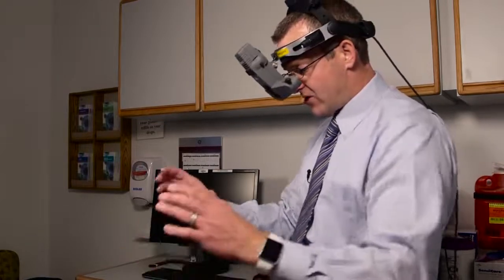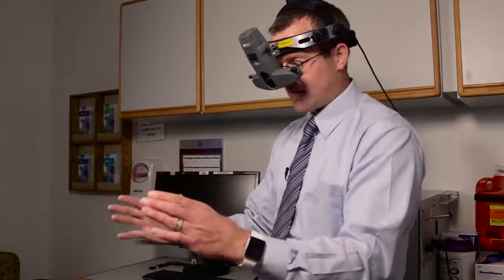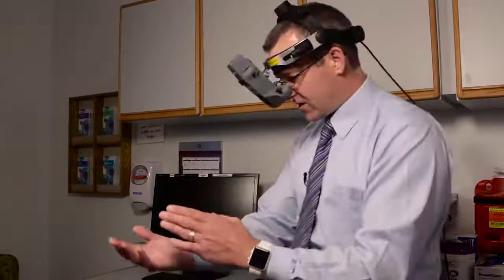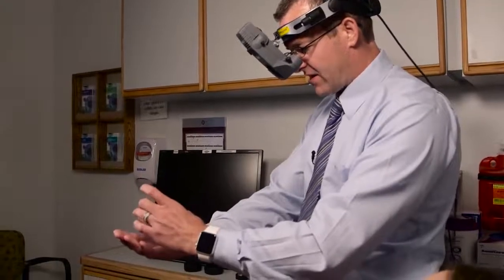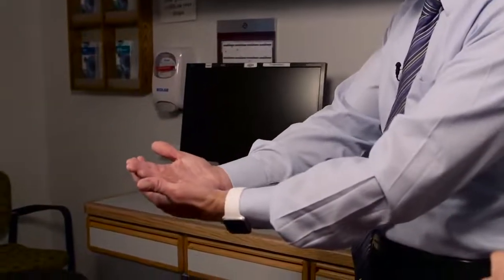Okay? And that way, when the two eyes work together, it'll give you the widest field of view, or it may cut off part of your view on one particular side, and that'll make it harder to focus in on that area. So, again, make sure the beam, literally every exam, I open and close each of my eyes, and I make sure that that beam is nice and centered for each eye. It'll be shifted a little bit nasal for each, and then as you open up both eyes, it should be right in the middle. I think that's a critical step. I literally do it thousands of times.